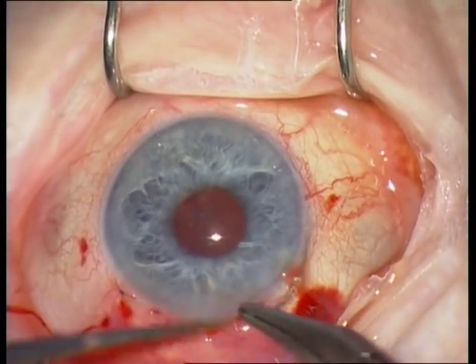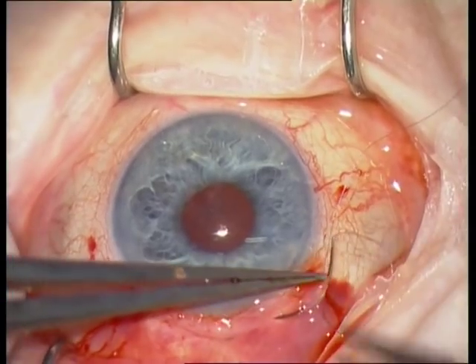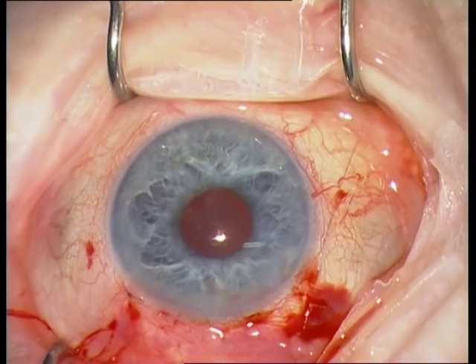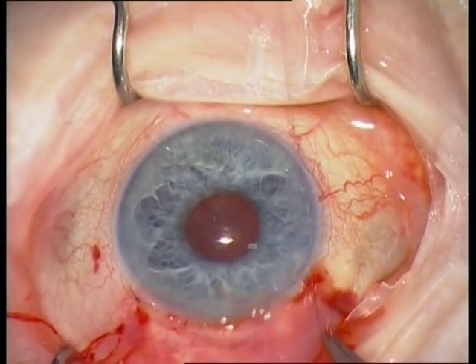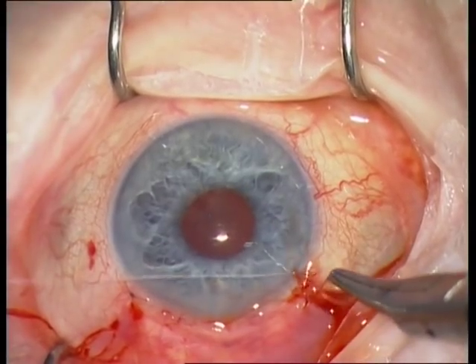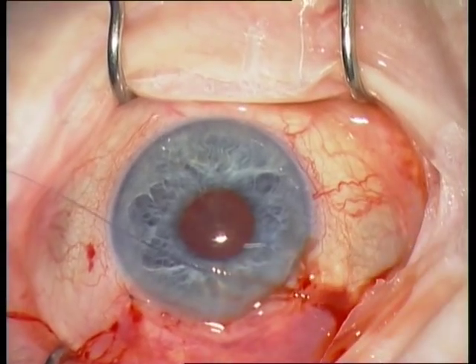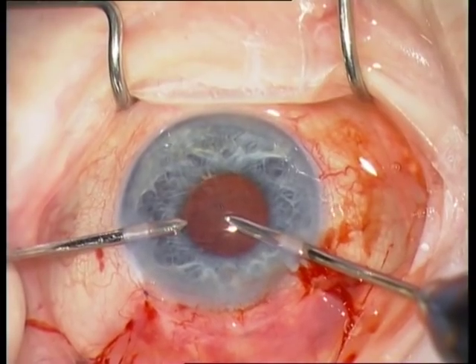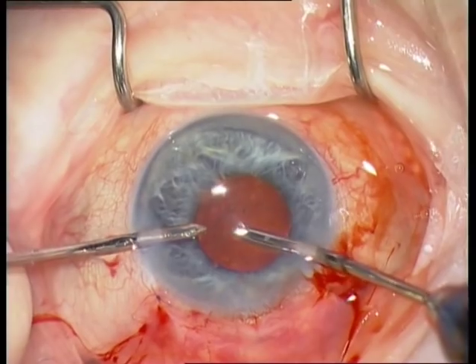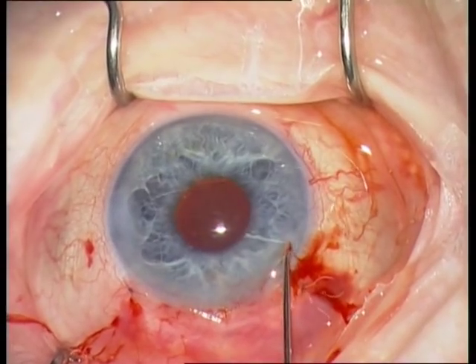The next step is the closure of the conjunctiva with Vicryl 8-0. The final steps are the removal of viscoelastics with the IA handpiece and the hydration of the paracenteses. Thank you very much for your attention.